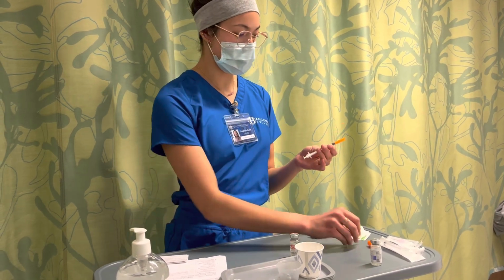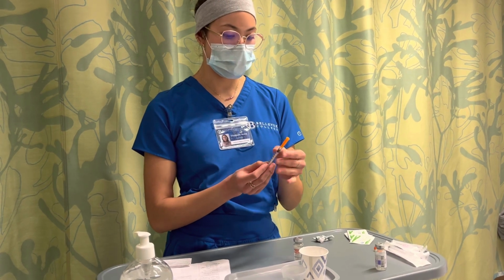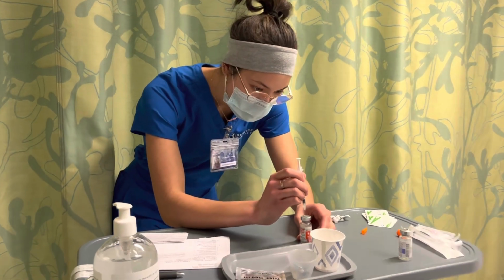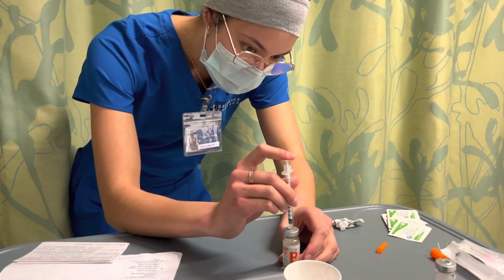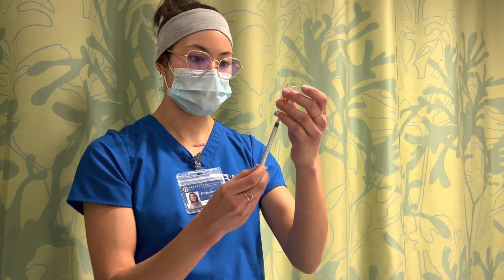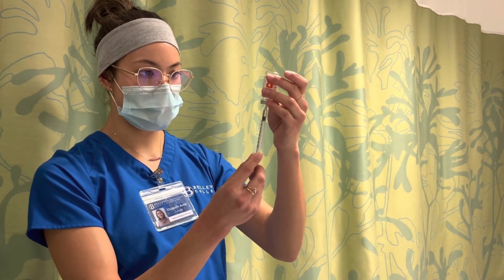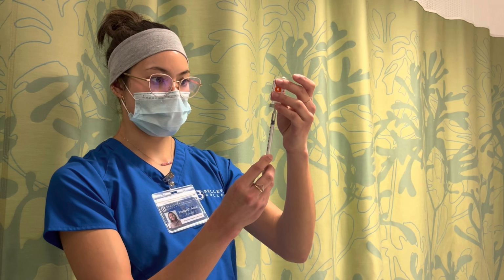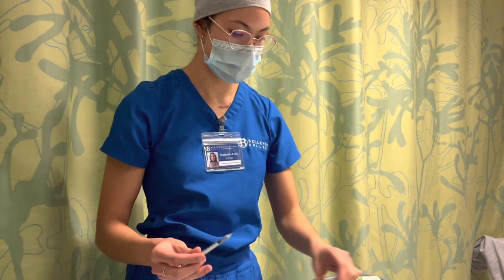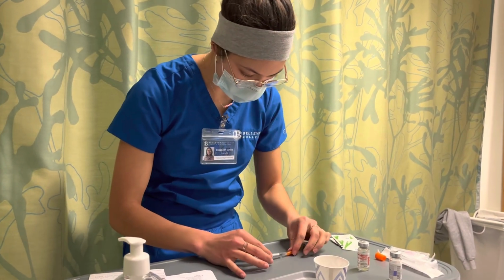So for 10 units, I'm going to draw up 10 air. And I'll draw up a little bit extra so that I can get rid of any air bubbles.